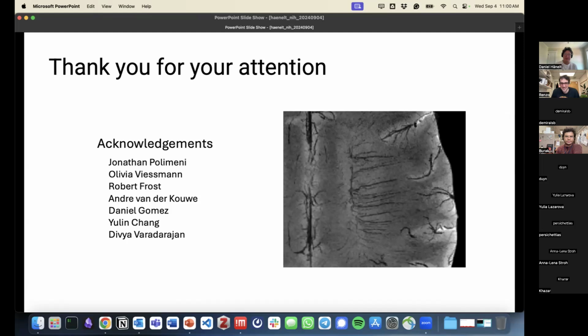I really like the navigator approach. It really worked well. Maybe you mentioned it, but this was a slab selective approach, so basically it was done in real time, right? You didn't acquire the navigators and then use them in the reconstruction later to account for it, but you literally recalibrated or changed the gradient waveforms for the next excitation pulse.